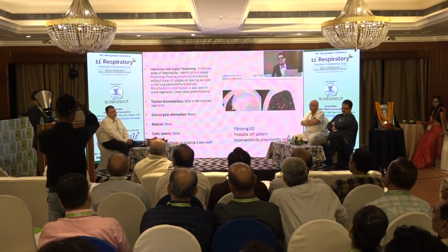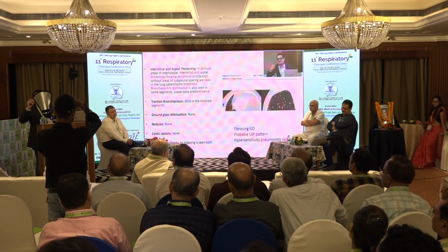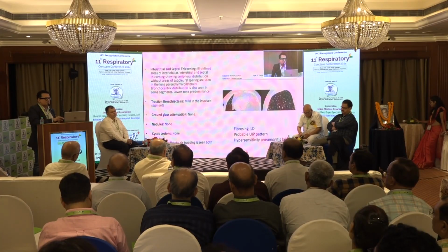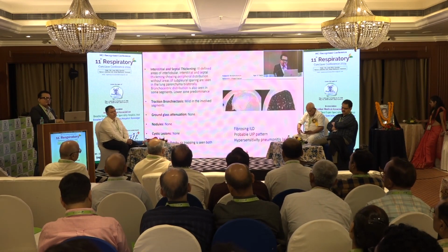Transbronchial lung biopsy in that earlier case, because she had reticular nodular opacities, gave a better chance of a diagnosis. But now transbronchial lung biopsy, as was shown by the previous speaker, is replaced by a cryo lung biopsy. You don't need to do surgery, but through the bronchoscope you can do cryo lung biopsy and make a diagnosis. For this particular patient, this was the differential diagnosis.